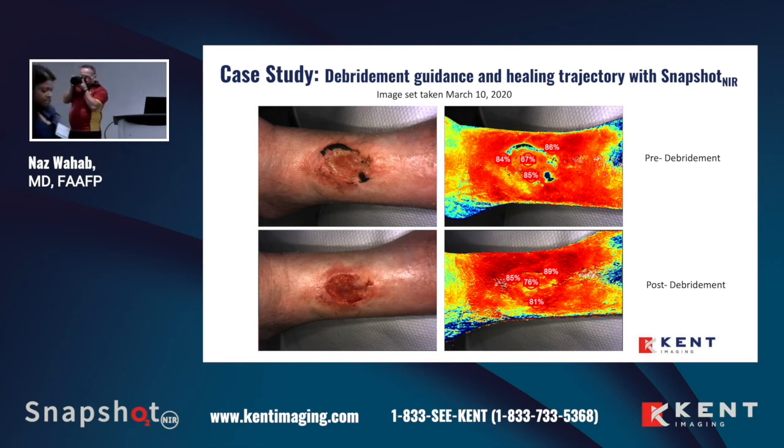And you can see here, just with debridement alone, you can see right here in the middle, it was 67% pre-debridement and post-debridement 76%. Yeah, it looks a little bit more clean, but it doesn't look significant by the naked eye on what was actually done. But we can see that also the peri-wound is improving as well.